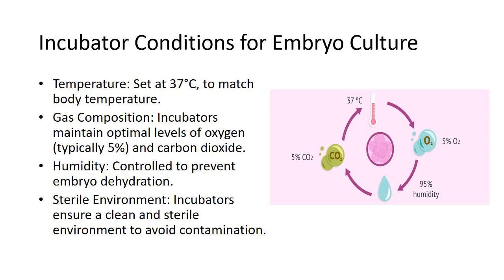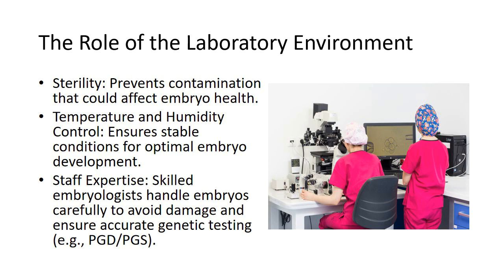Embryo handling. Handling embryos with care is critical, as embryos are highly sensitive to mechanical stress. Advanced equipment and sterile techniques are used to minimize exposure to contaminants or temperature fluctuations. Two, the laboratory environment in ART.